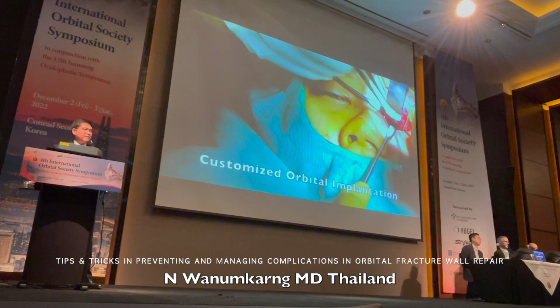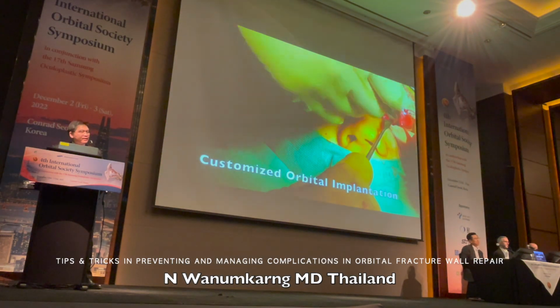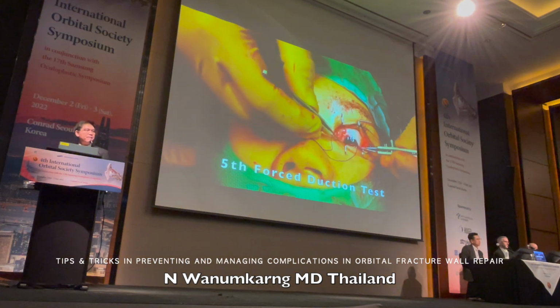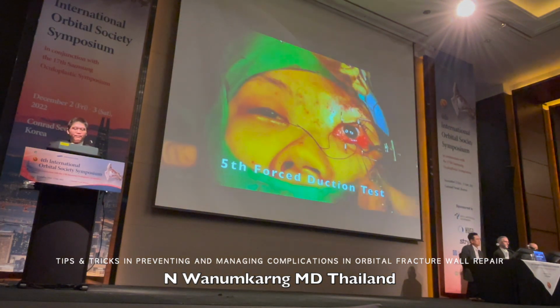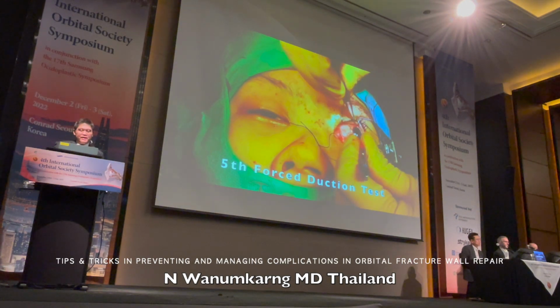But when we put the implant in, sometimes it's too tight, sometimes it's too small. So we can do another customization by drilling or shaping the PMMA implant.